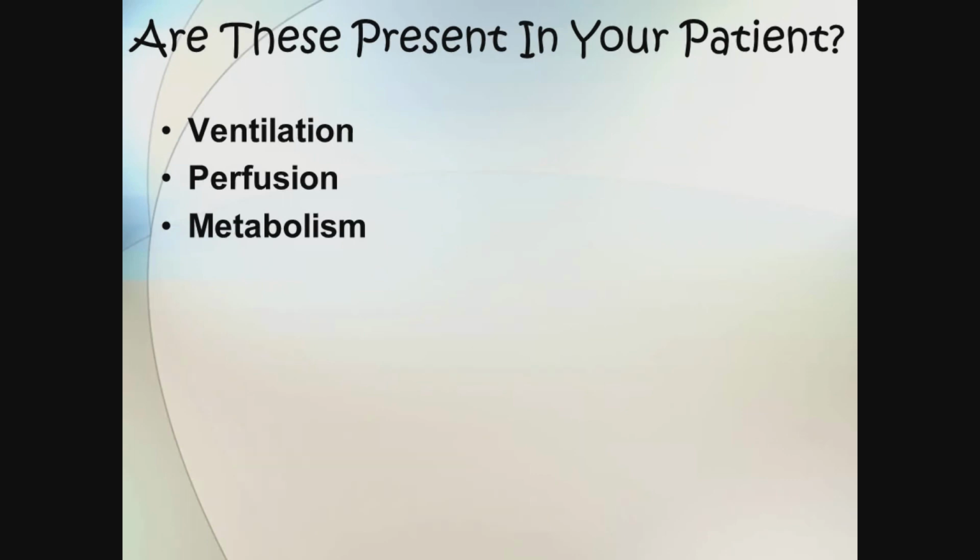We rarely, if ever, use it. Every single patient who is in the OR undergoing general anesthesia is monitored with end-tidal CO2. Any patient who is receiving conscious sedation should be monitored with end-tidal CO2. And I know that's not done either.